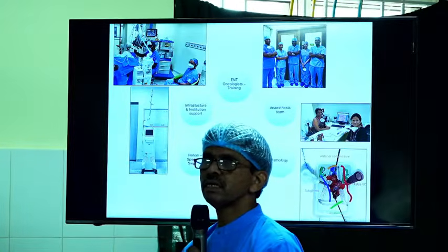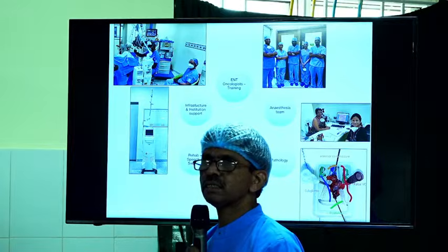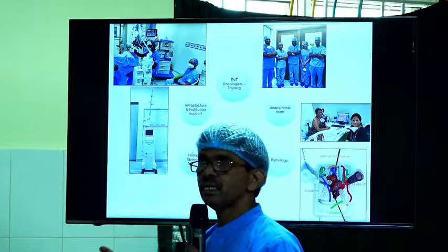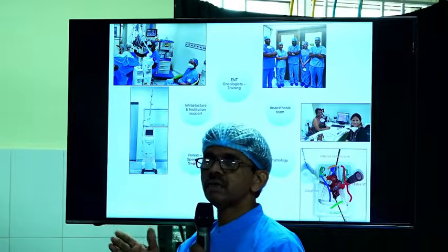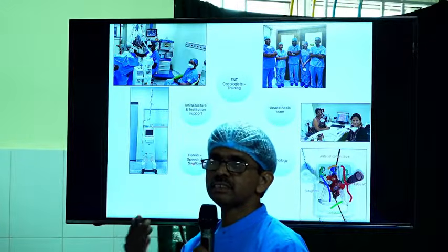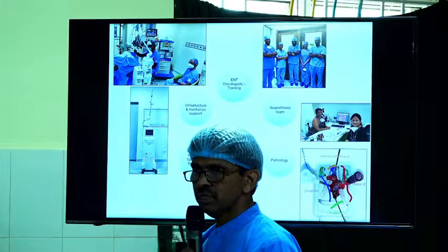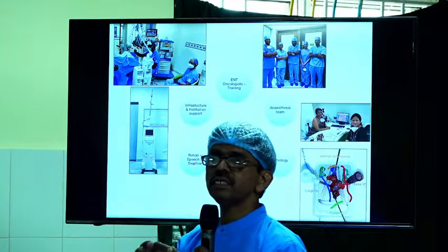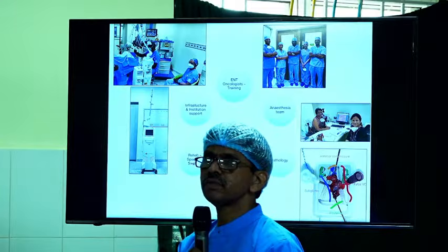Especially when you are excising a pre-malignant or malignant lesion on the vocal cords, you can excise with a normal margin as he described. You can discuss with the pathologist why this is important.